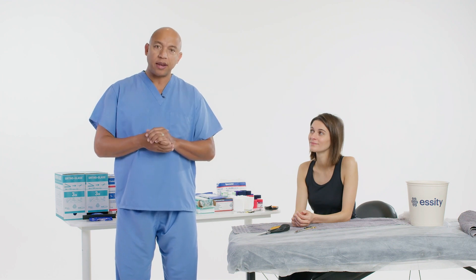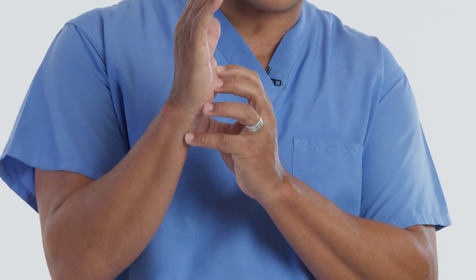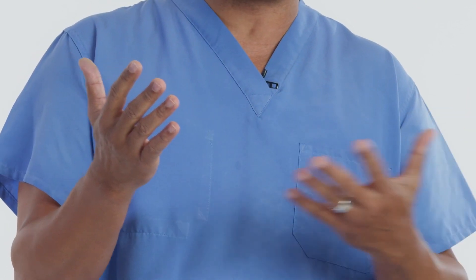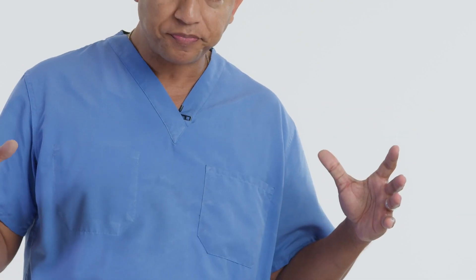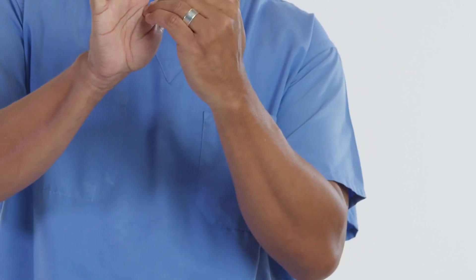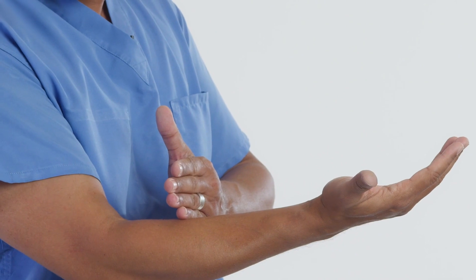It makes it a lot easier and expedites the curing stage. With this particular splint, it's going to be on the volar surface and the injuries are going to be concentrated in the patient's wrist. The injury could be as simple as a sprain, a small fracture, or some type of cellulitis — just involving immobilizing the patient in a position to allow for inflammation. We're going to stop the splint at the distal palmar crease, going at an angle going down, and also ensure that it terminates at the antecubital space, one or two inches.